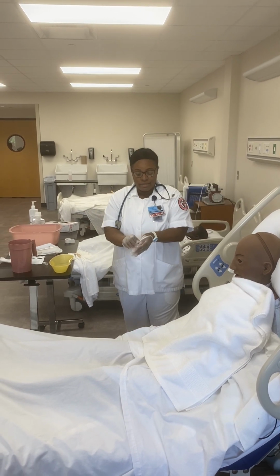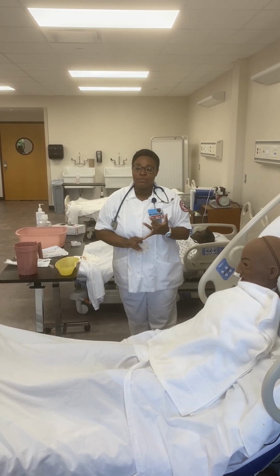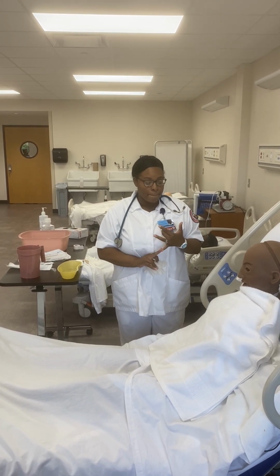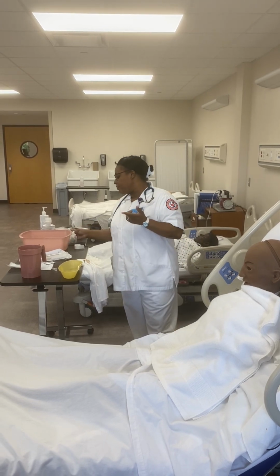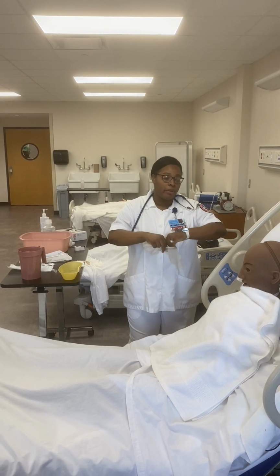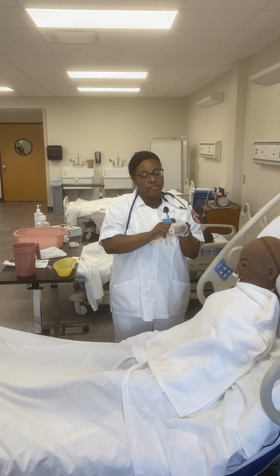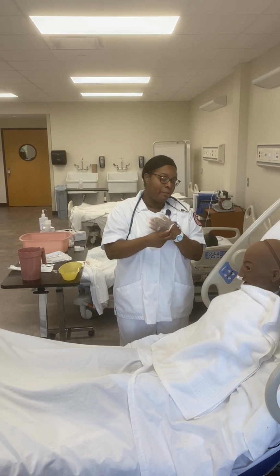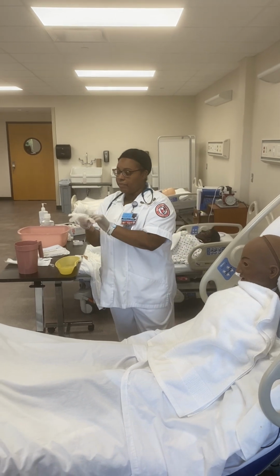I will remove my gloves, perform hand hygiene, document the procedure, document the patient's response, document the naris and nostril used, and then I would also perform oral care and nares care on my patient prior to removing my gloves. Or I can come right back and do it, but definitely will perform oral care and nares care on my patient.